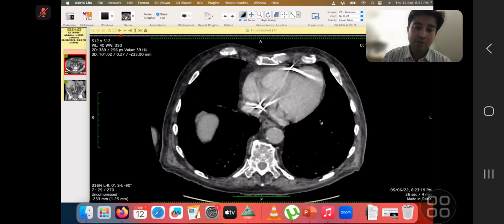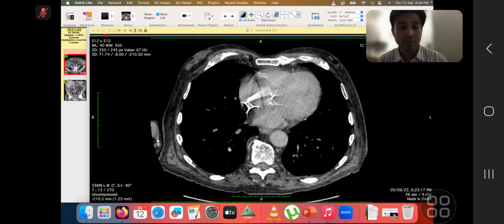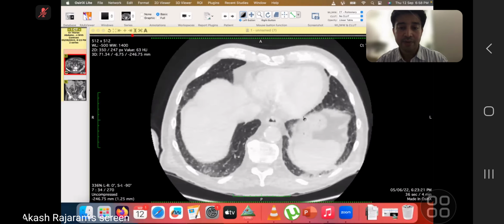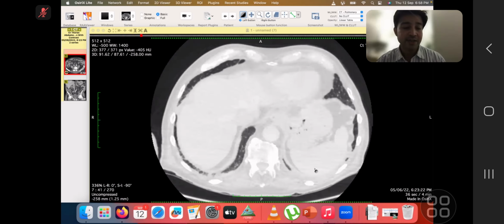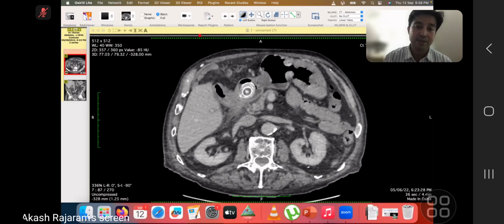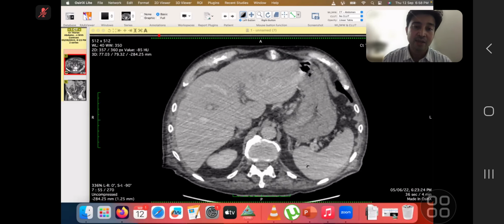Also, in such cases, you need to look at the lung window, which you didn't mention. You should say in the exam, even if they don't show you, always mention that I would like to look at the lung window, because these patients have a risk of aspiration. You can see there are some densities over here. So they're always at risk of aspiration. Whenever you have any GI case, you always say that you would like to look at the lung and bone window. And if the examiner doesn't want to show you, he'll be like, yeah, there's nothing in that.